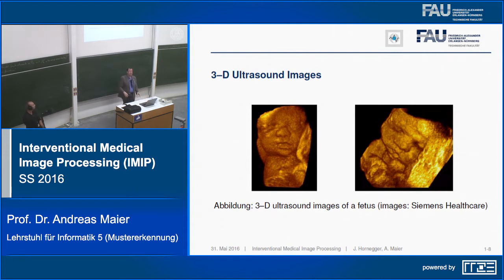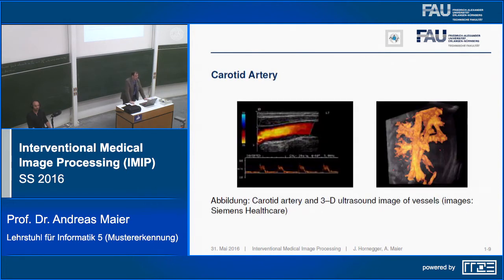If you do 3D, then you can acquire the full volume, and then you can also realize effects like that something has left the volume. And of course, a very nice application is, again, fetal imaging, and you can actually visualize the face of an unborn child. So the first time you can see your kid nowadays is not after birth, but you can also have a look at the face of your future child already during pregnancy. Another application is measurement, which is also very relevant, but not as exciting images as these, of course, in particular when you're going to become parents very soon.